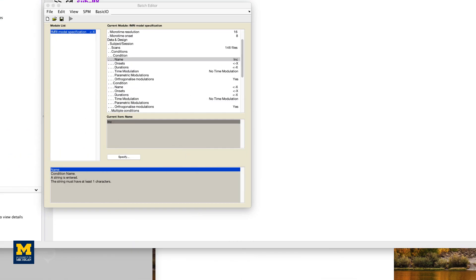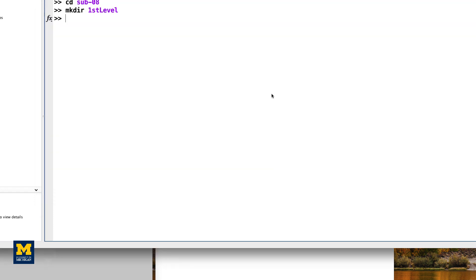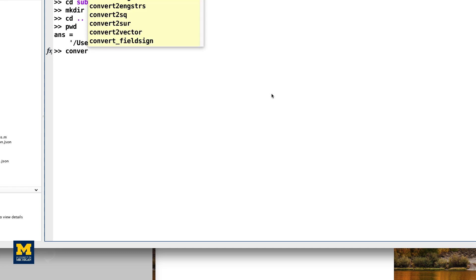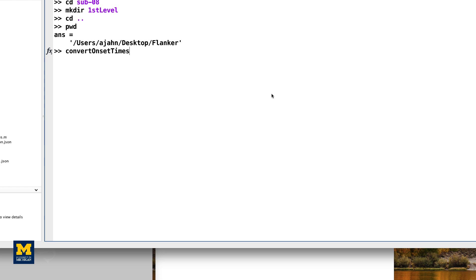From the MATLAB terminal, make sure you are in the Flanker directory and type Convert Onset Times. This will convert the .tsv files into onset times text files that can be read by SPM.